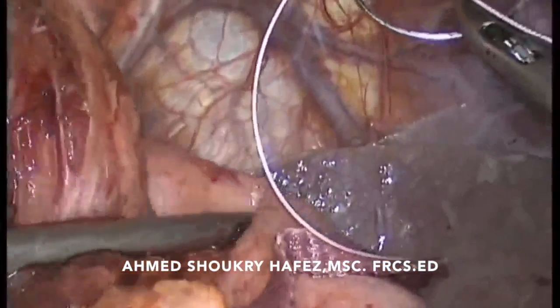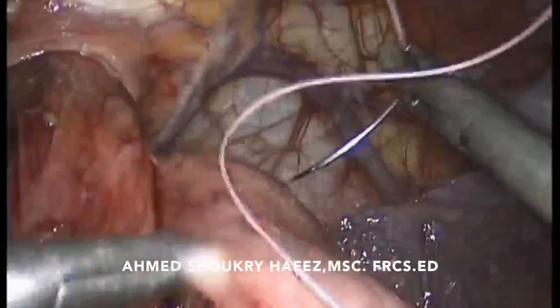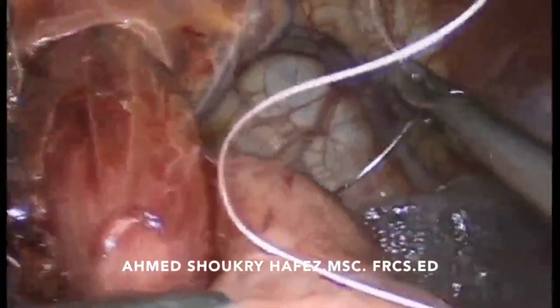The same is repeated now on the left side of the wrap to fix the edge of the stomach to the side of the esophageal wall.